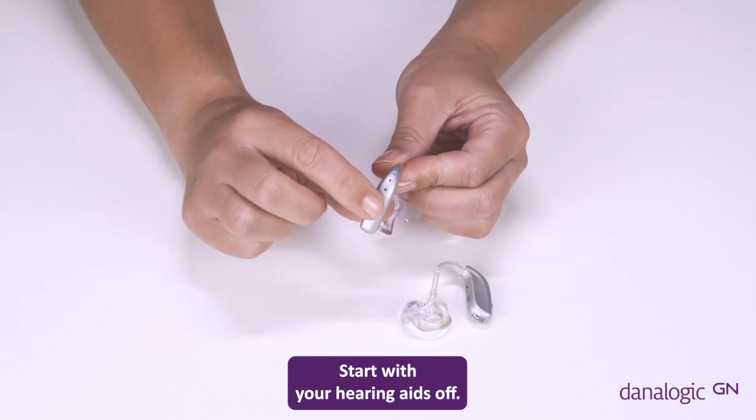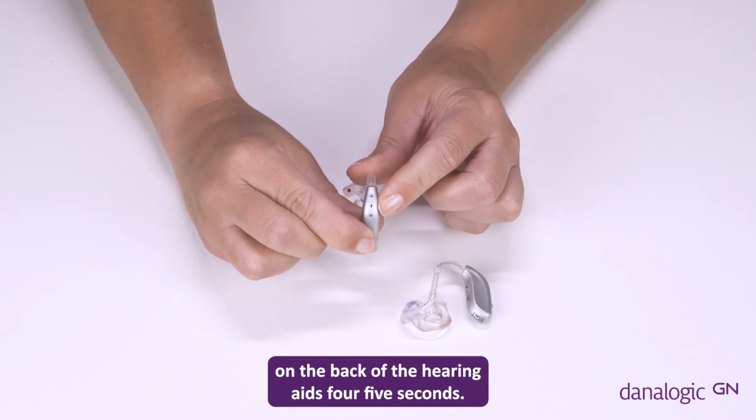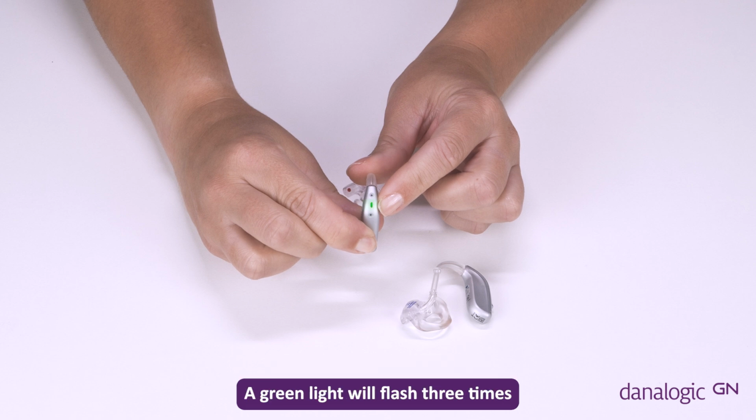Start with your hearing aids off. This is achieved by holding down the button on the back of the hearing aids for 5 seconds. A green light will flash 3 times to signify the hearing aids turning off.